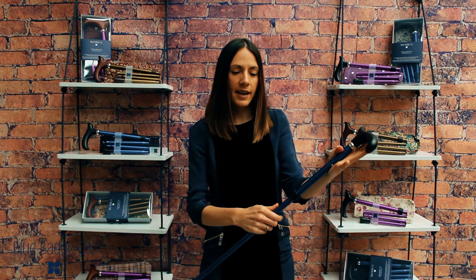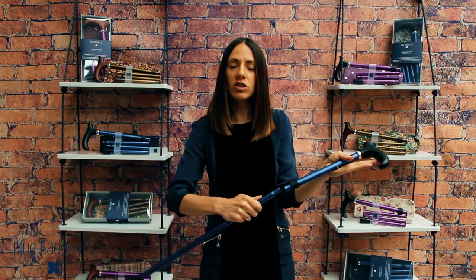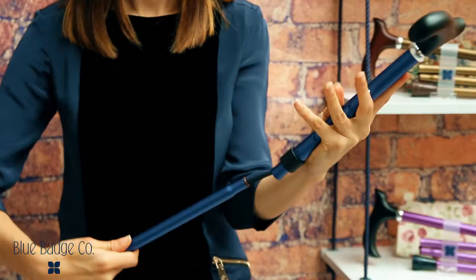To fold your stick together, hold the top section in your hand and take the next section in your other hand. Then turn it slightly and pull it out — it's just like a tent pole. The turn is to loosen any pressure that may have built up whilst using the stick. Then fold that section up and take it into your other hand.